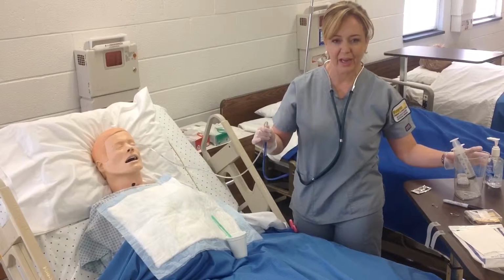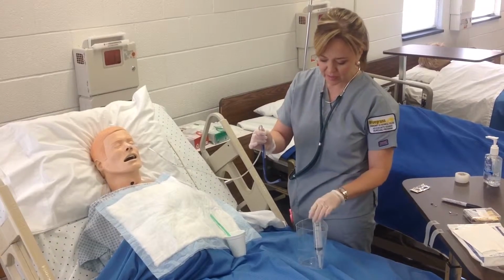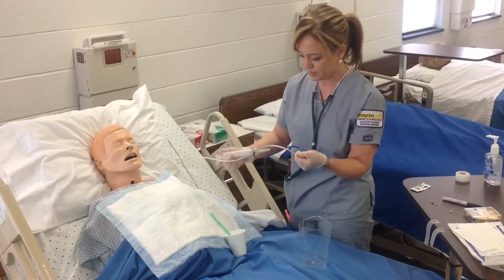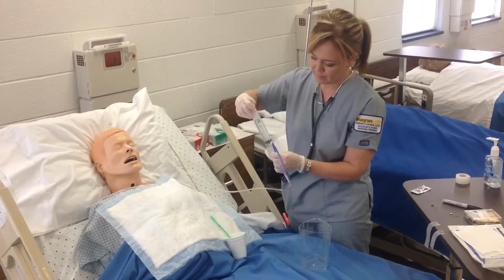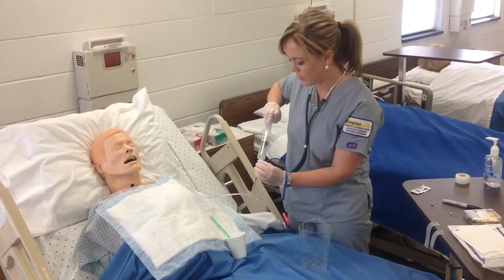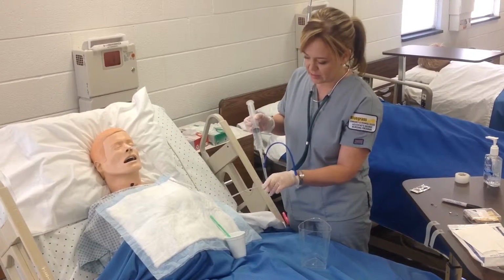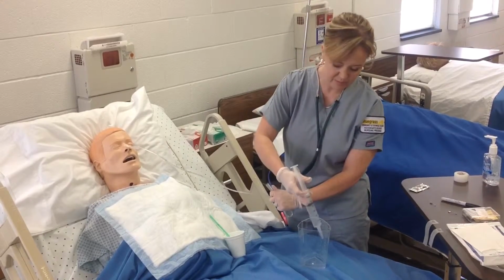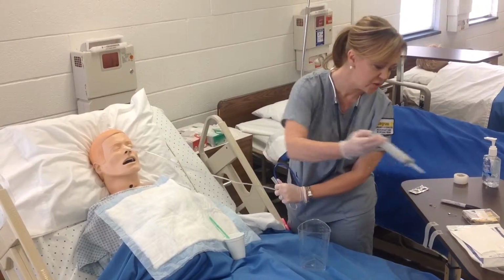I'm going to verify placement of the tube by measuring the pH of the aspirate. So I would aspirate the contents of the stomach. It looks like the stomach contents have stopped now, and he's right at 40. There isn't anything else coming out. So I'm going to put most of that back in here so we can just have a little bit for our pH strip.